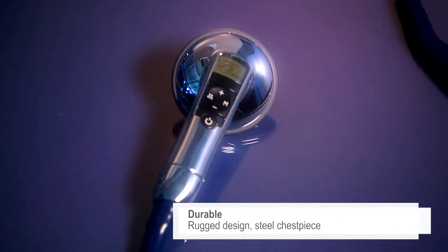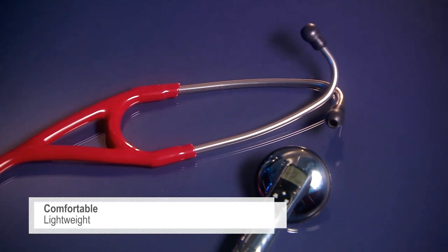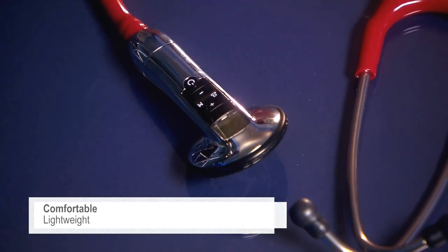The ruggedly designed, highly durable metal chest piece is made to withstand the most challenging environments, but without sacrificing comfort. The electronic models are surprisingly lightweight, the same as our most advanced non-electronic cardiology stethoscope.